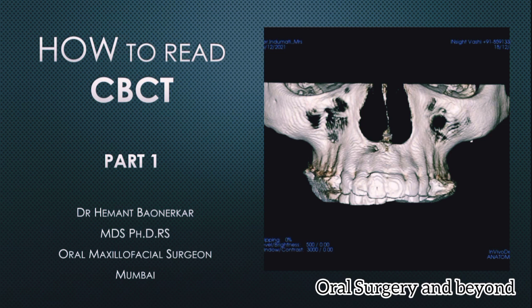Hello friends, today we are going to learn how to read a CBCT. As I have already covered how to read IOPA and OPG in our radiology learning series, now we proceed to how to read CBCT, part 1 video. Today we are going to cover the introduction and the basic advantages and indications.